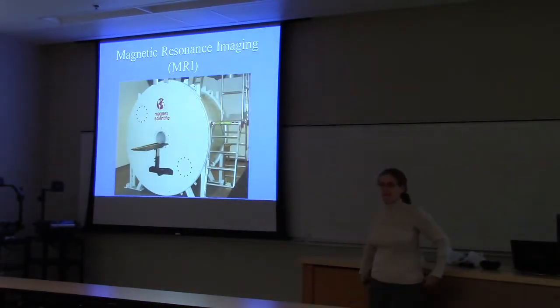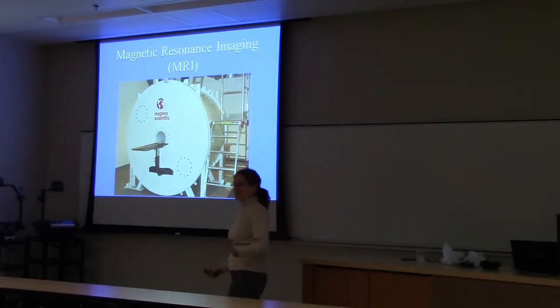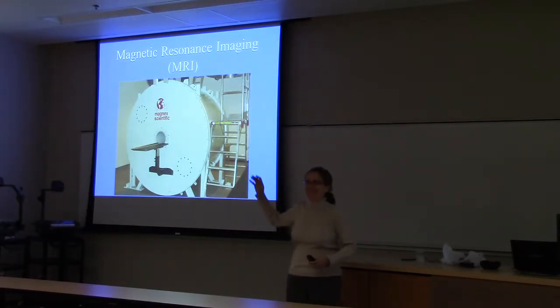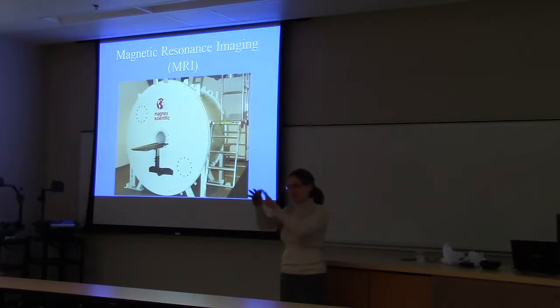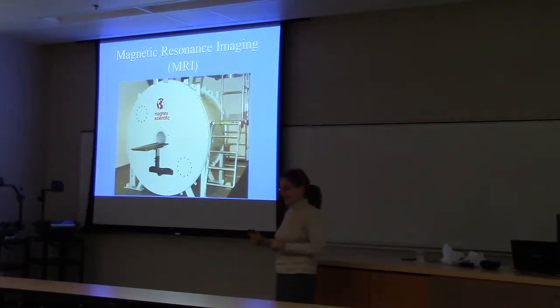So, how many of you have heard of MRI before? Yay, that number is going up. It's almost everybody now. How many of you have had an MRI before? Was yours clinical or research? All of the above. Me too. I can tell you I like clinical magnets much better than research magnets. Research magnets, the bores are really tight and they're very dark. Clinical ones, they've got lights and it's big.